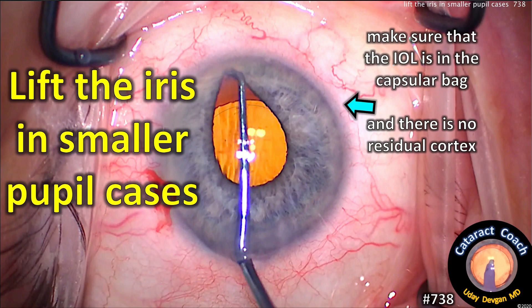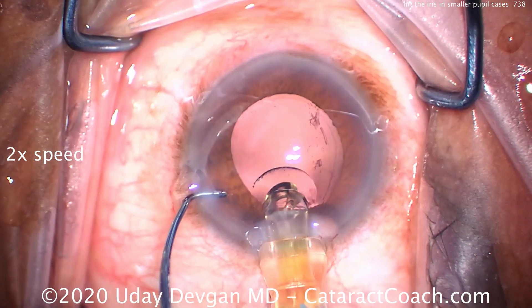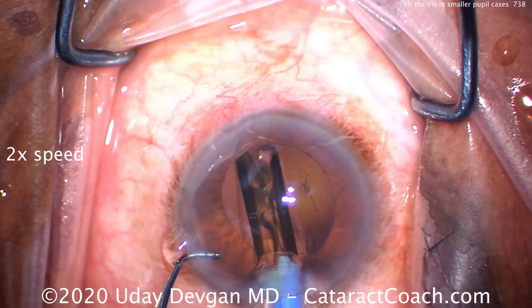CataractCoach.com. Lift the iris in smaller pupil cases. You can make sure there's no residual lens material and if the IOL is in the capsular bag. So let's watch a couple of cases here.